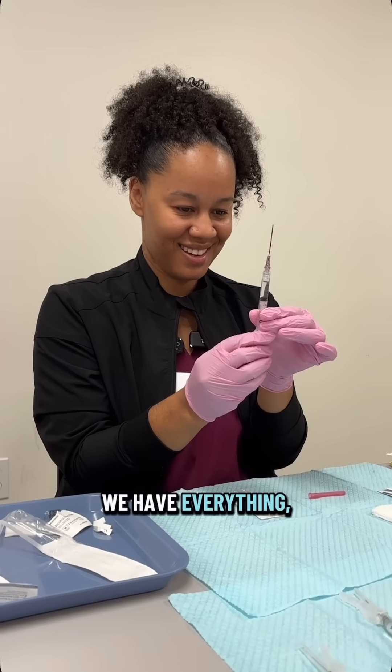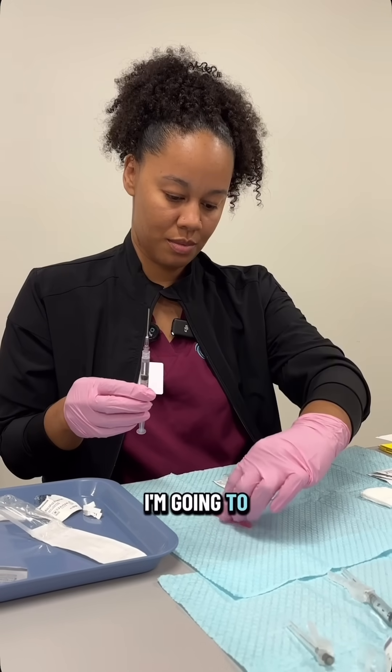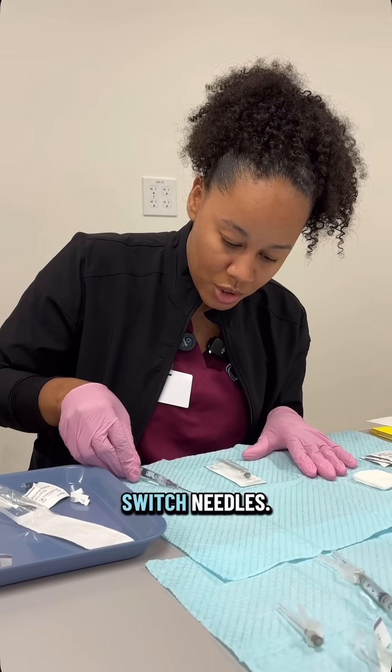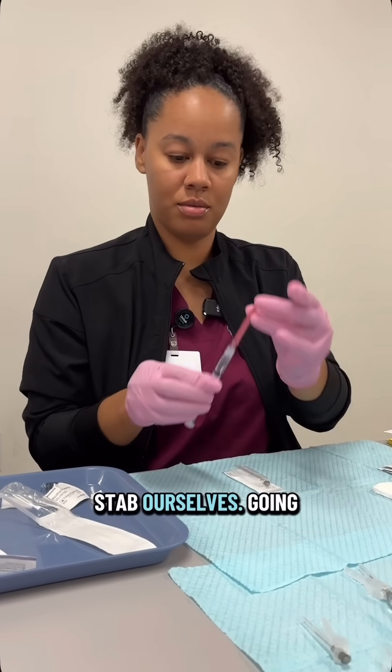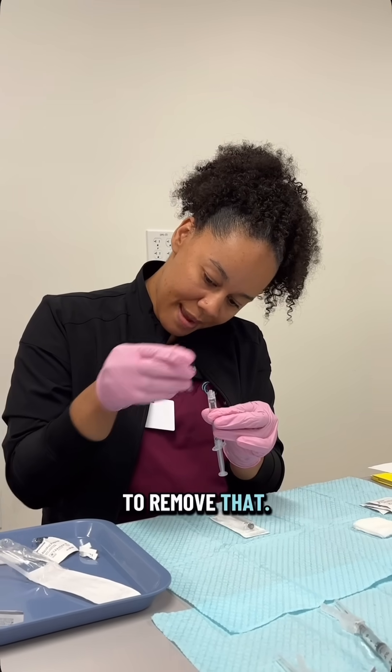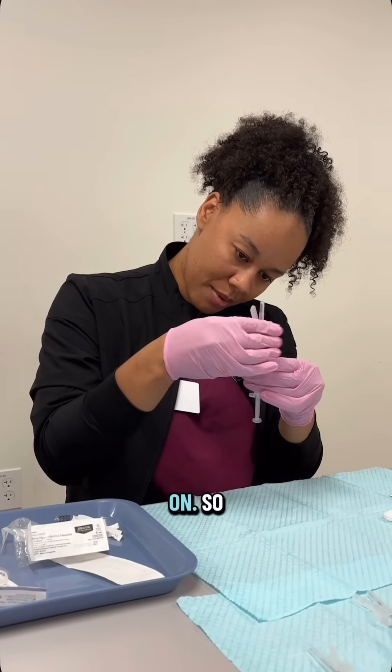And now that we have everything, I'm going to put the cap back on so I can switch needles. We'll always use the scoop method so we don't stab ourselves. I'm going to remove that and screw this cap on.